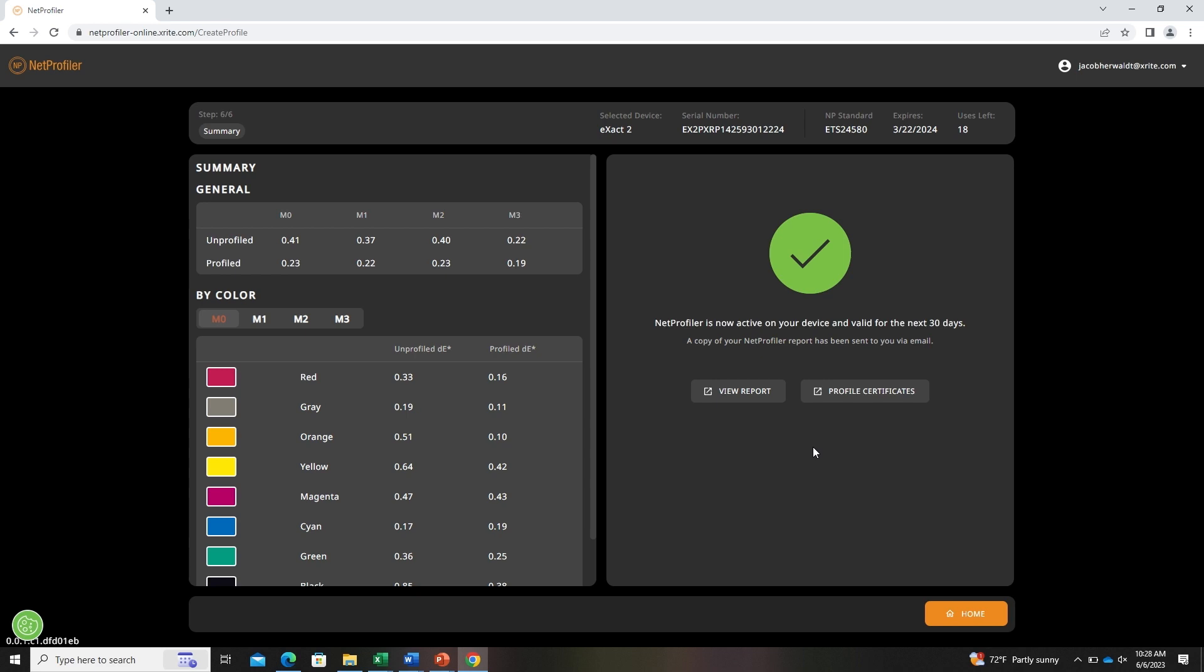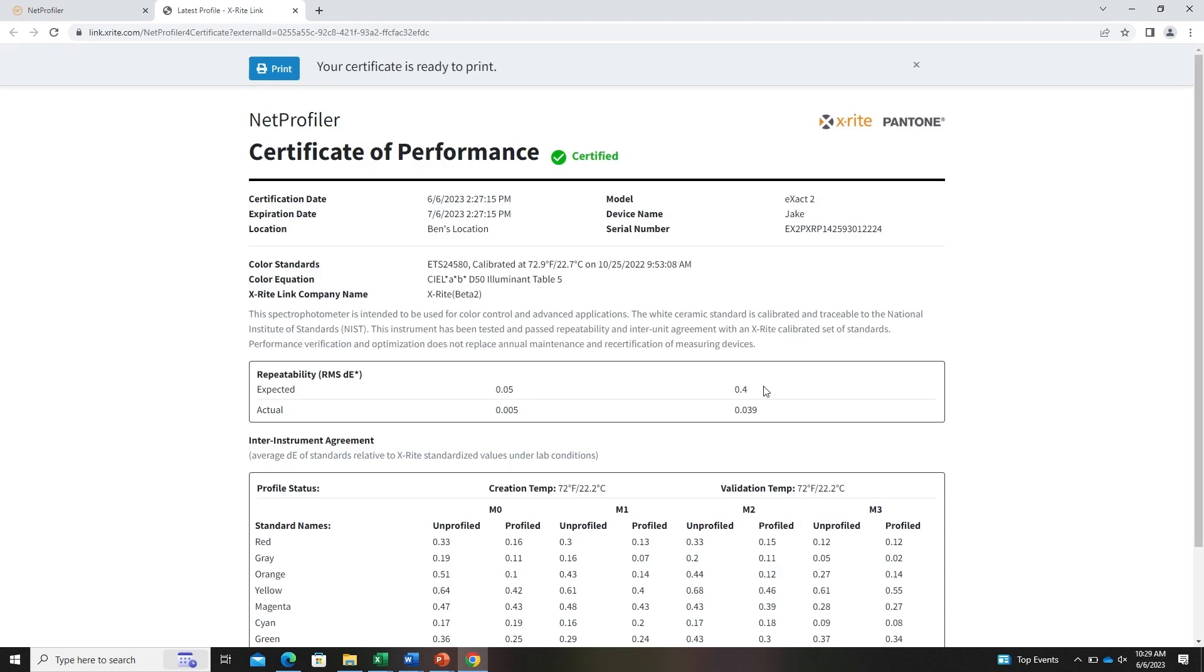On the left side of the screen, you will be able to see the measurement data for each measurement condition, also for unprofiled measurements versus profiled measurements. From there, you can view the report. This will be similar data to what you saw on the previous summary page.